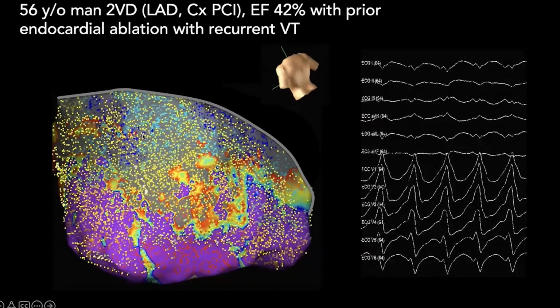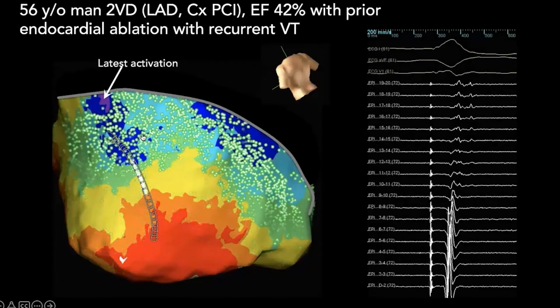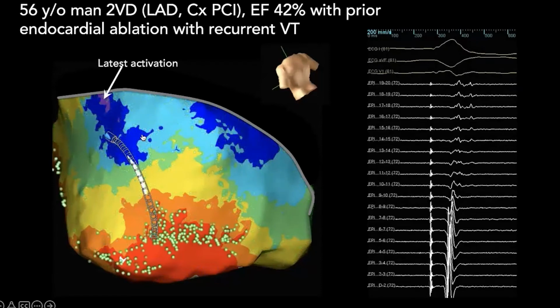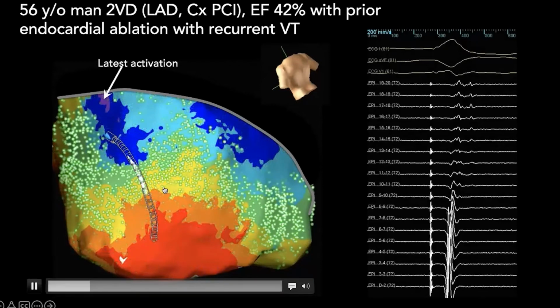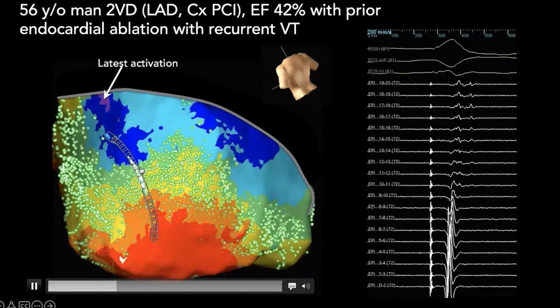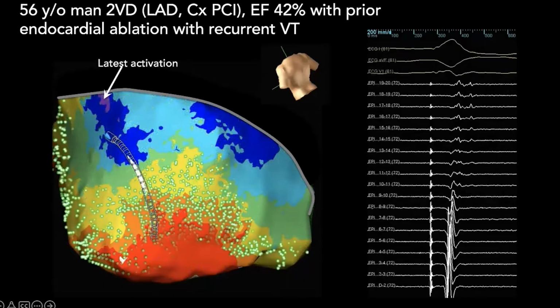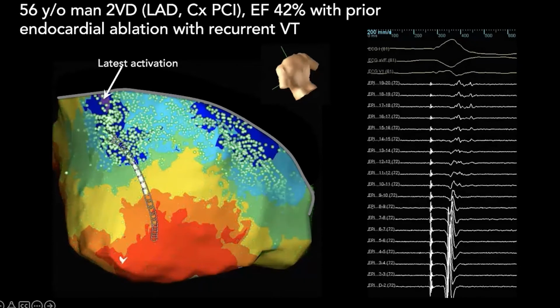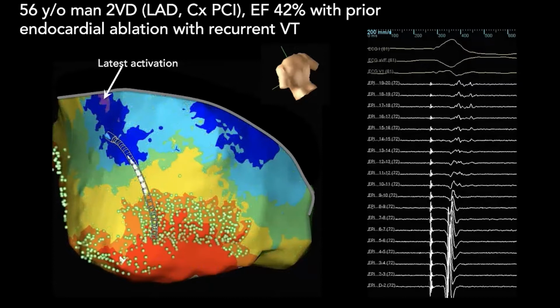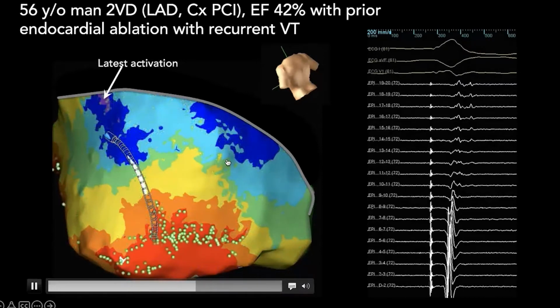When we change this to an isochronal map and you actually propagate it, you can see there's 2 areas of wavefront discontinuity and deceleration zone. Here, specifically, you have green, light blue, and dark blue, which is 3 colors within 1 centimeter, which is how we define a deceleration zone. And then you also have an area that is a potential area of deceleration here.